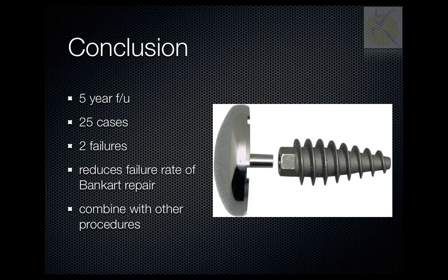We found this therefore to be a reasonably reliable technique in combination with a Bankart repair or also with other procedures to restore congruity of the glenohumeral joint.